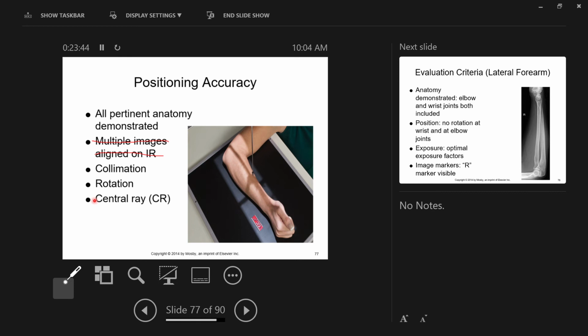Your car headlights do the same thing. The beam spreads out as it travels away from the headlight. The same thing is true of the X-ray beam. Now, I'm hesitant to get out my flashlight right now and show you the flashlight move. But the point is, the middle of the X-ray beam is going to show the anatomy the best, right? It's going to have the least amount of shape and size distortion, okay?